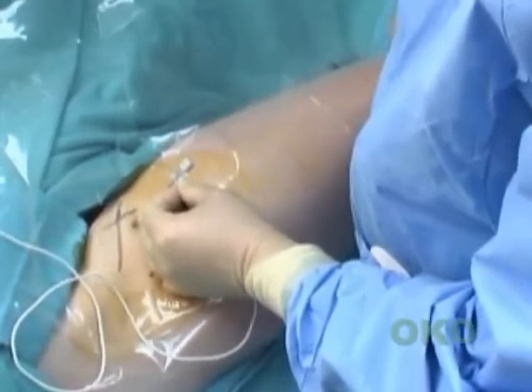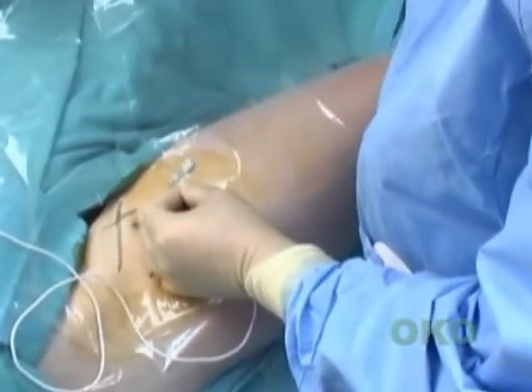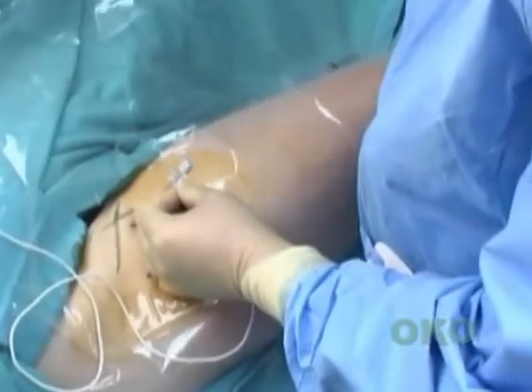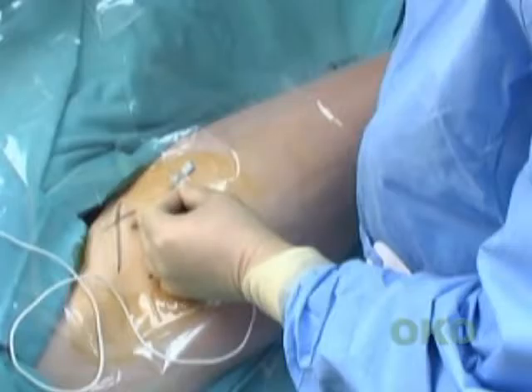This ensures correct needle placement deep to the iliaca fascia, but it does not assure accurate catheter placement. It is essential not to inject any local anesthetic agent or other electrically conductive fluid, such as normal saline, through the needle at this point, since this will render stimulating catheter placement impossible.